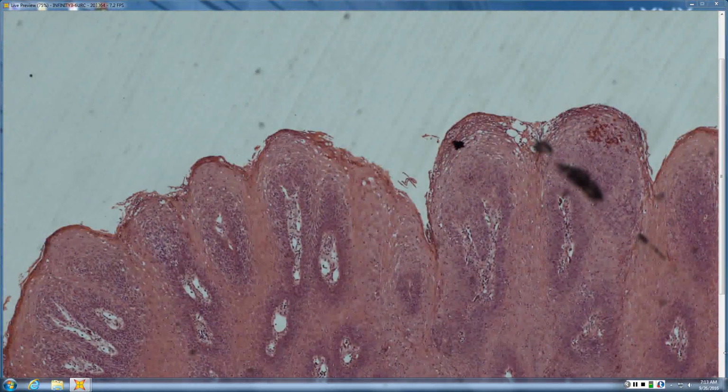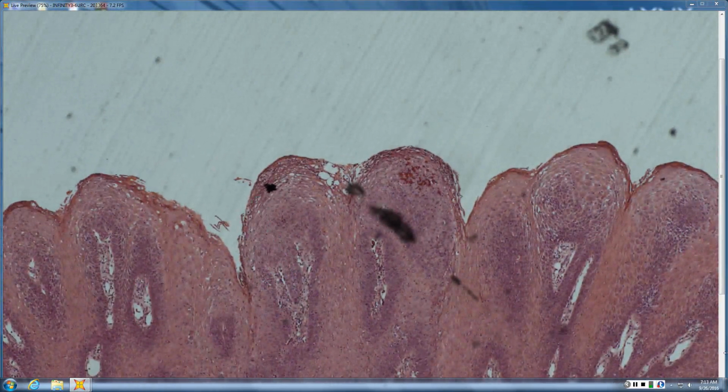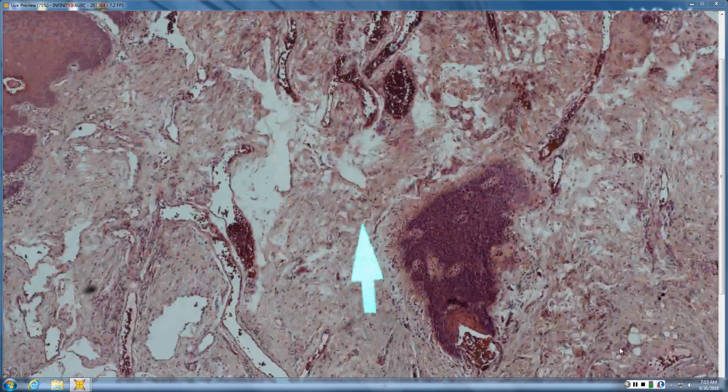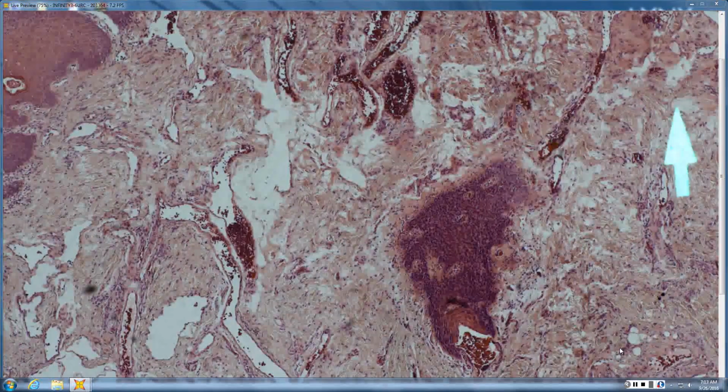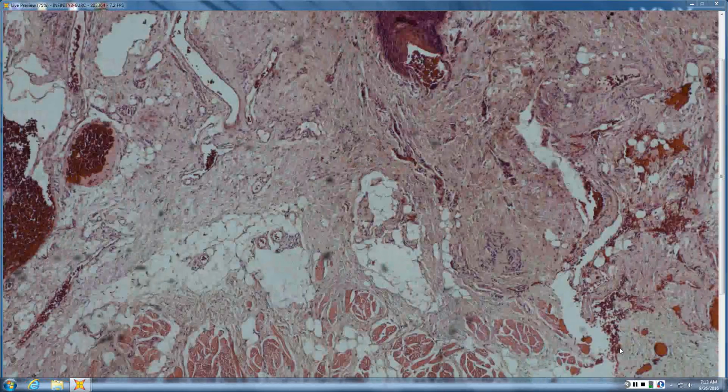That differential could be candida. I mean, it wouldn't be sebderm, but it can be other things, infection. There's other things that can happen in the mouth, infection-wise, that can produce a similar appearance. But basically, it's a psoriasiform acanthosis, because you still get acanthosis. It's not supposed to be that thick, and then the neutrophils in the mucosal horn. And other features of this being mucosal skin are the lots and lots of vessels, plus skeletal muscle. Now with the tongue, usually you get a ton of skeletal muscle if it was a deeper biopsy. But that's just geographic tongue. And it's unlikely to be on your boards.